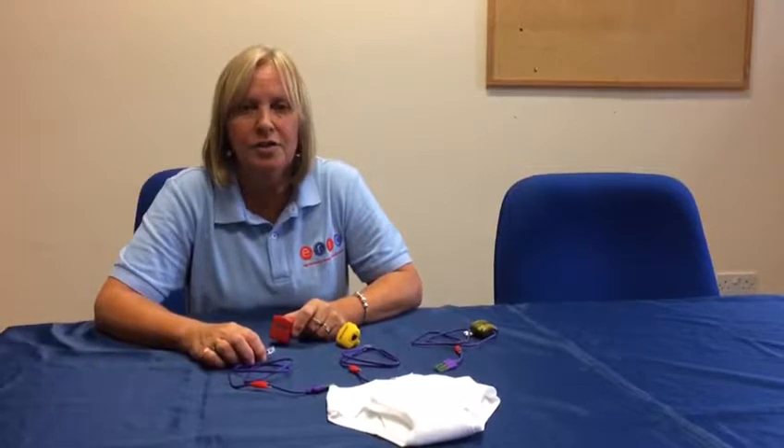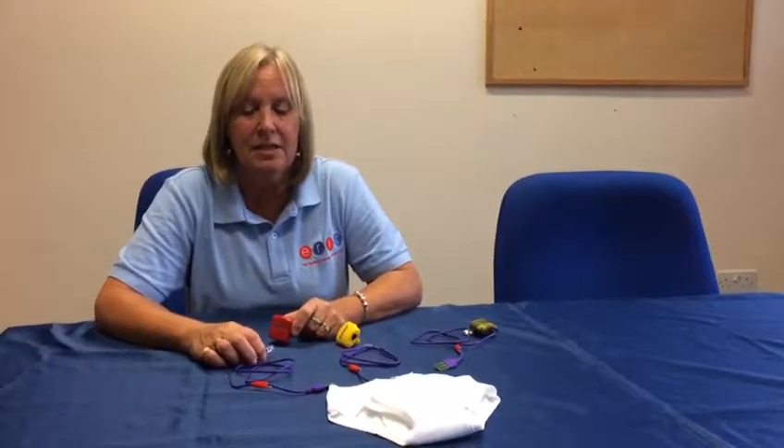My name's Jane and I work for ERIC, the Children's Bowel and Bladder Charity. Today I'm going to talk to you about the M03 Body Worn Alarms.